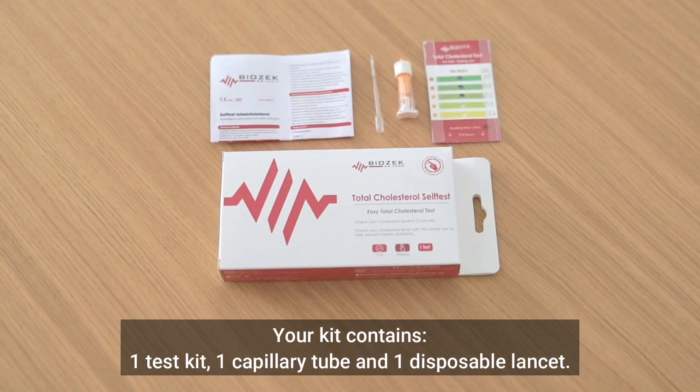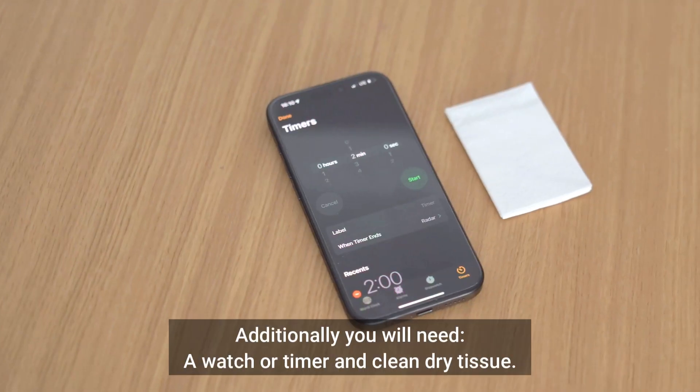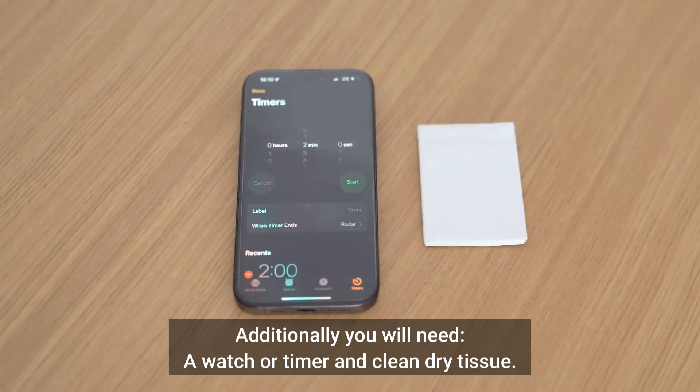Your kit contains one test kit, one capillary tube, and one disposable lancet. Additionally, you will need a watch or timer and clean dry tissue.